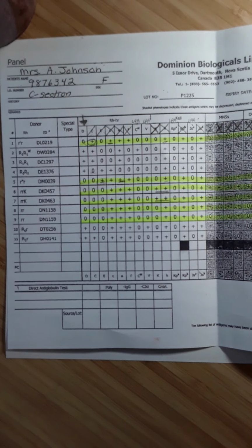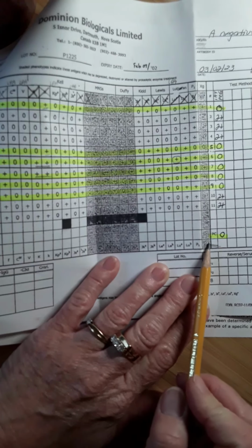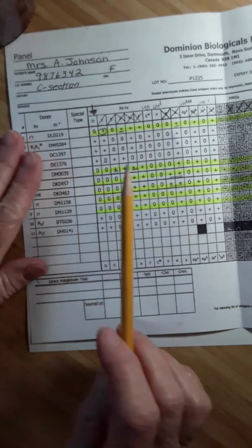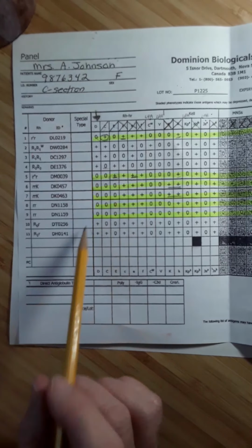People make antibodies against antigens they do not have and have possibly been exposed to through pregnancy and transfusion. So it's a check on our antibody ID. We should find that if the patient's autocontrol is negative, the patient's antigen type will be negative for the antibody that they have produced. Please let me know if that doesn't make sense to you.